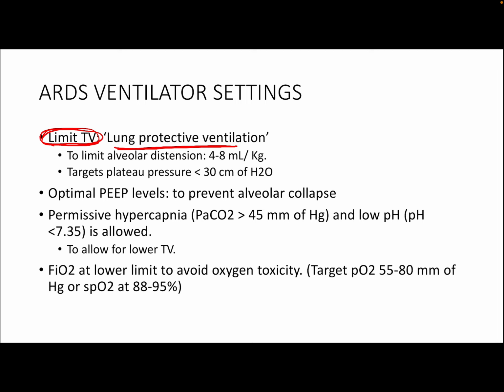So here we are trying to limit the alveolar distension and we give about 4 to 8 milliliter per kg, and we target a plateau pressure of less than 30 centimeters of water. In case of ARDS, we can use a volume limited or a pressure limited AC mode, and many studies have shown that a low tidal volume actually reduces mortality rates in ARDS patients who are ventilated.